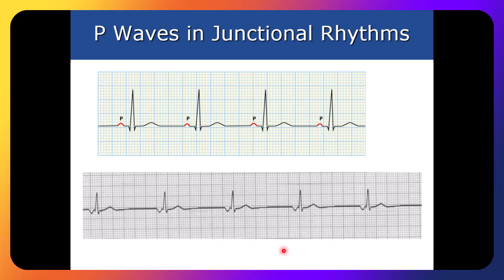I know that you said they're regular. They are regular. Yeah, Braden. No, the QRS will be normal. Now remember, if you look at this QRS, does it look like it's a normal width to you? I hope you nod your head yes, because it is perfectly normal. Normal is anything less than 3 small boxes, which is 0.12 seconds or 120 milliseconds. Say it again. Not longer.